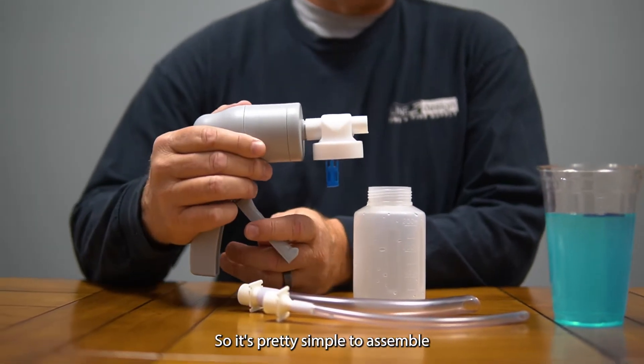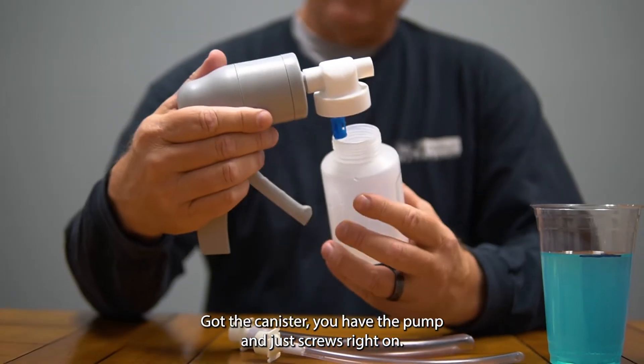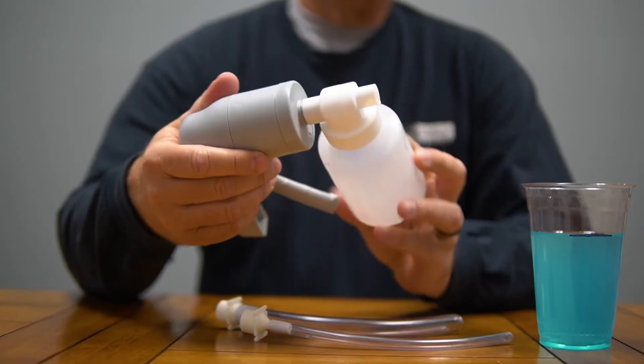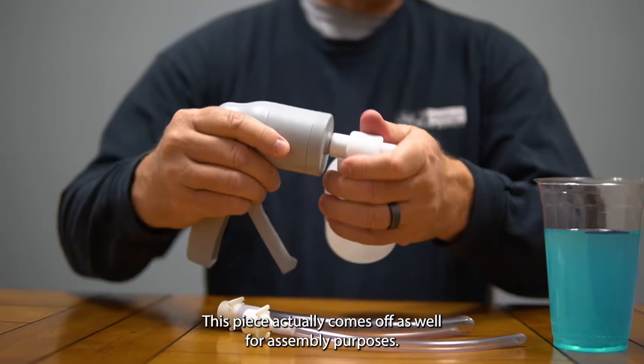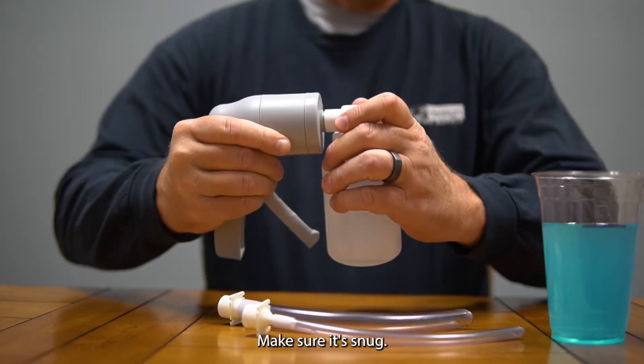It's pretty simple to assemble. You've got the canister, you have the pump — it just screws right on. You can clean it out. This piece actually comes off as well for assembly purposes. Make sure it's snug.